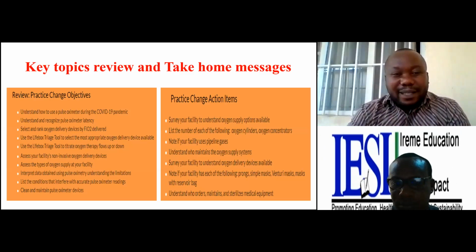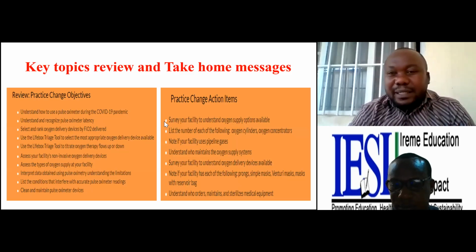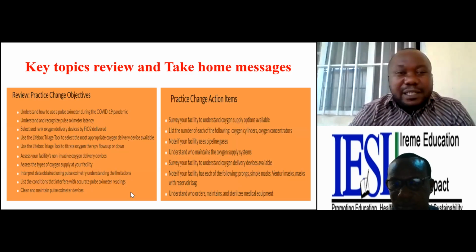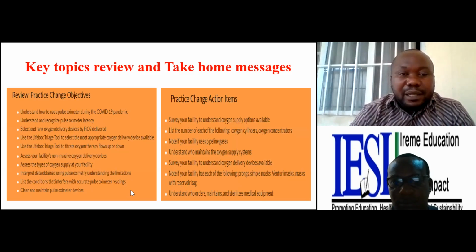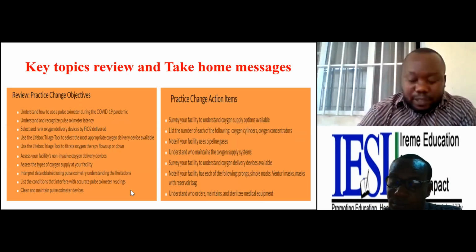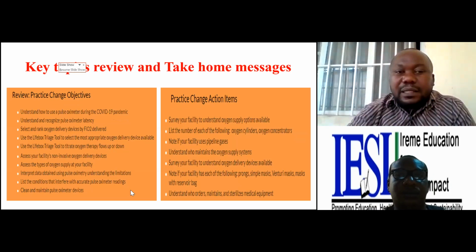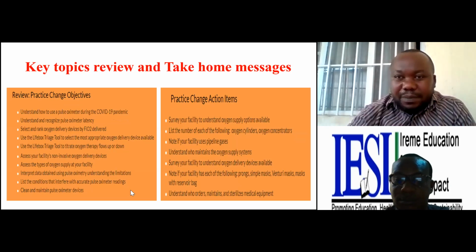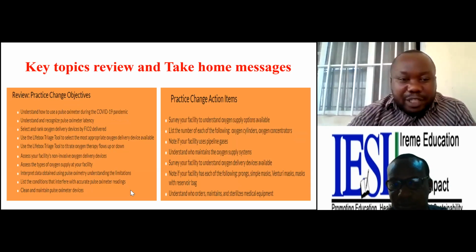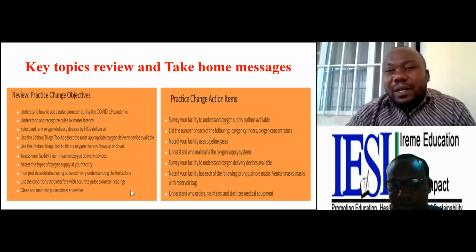Yes, I think from our discussion, we already have our take-home message. Our take-home message is to go back to our respective health facilities and change practices: knowing how to use a pulse oximeter in oximetry, understanding when and how it is used, what the interferences are, and what the limitations of the pulse oximeter are. And from here, don't just report the number you are reading.